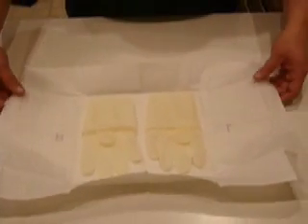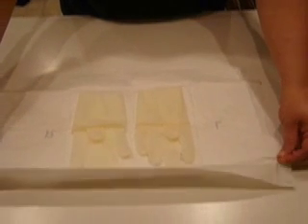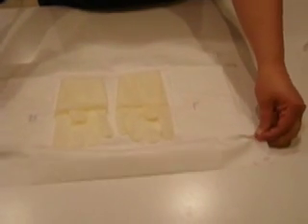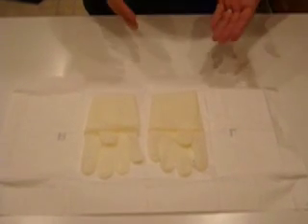When you open this up, make sure you don't let go of the sides. Walk your fingers up and down the sides to make sure it stays open so it doesn't fold itself back onto your gloves. I usually glove my left hand first, but you can glove either one — it doesn't matter.